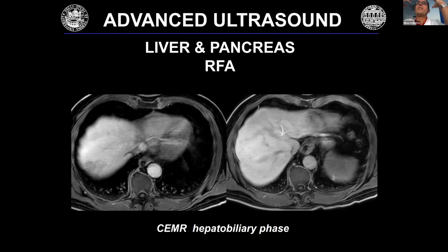So you can think about what is better for a patient in case you want to treat, or biopsy also, a lesion that is visible only with MRI. In a radiological congress, you will hear about the possibility to biopsy this lesion under MRI guidance. Yes, why not? But it's for sure more expensive.